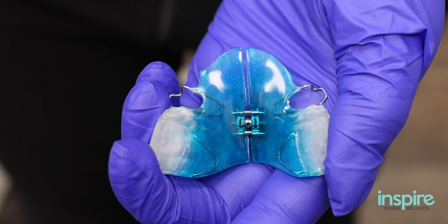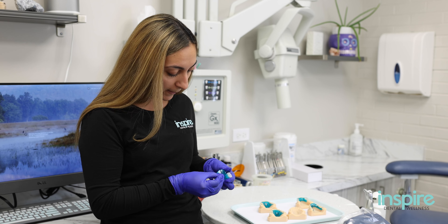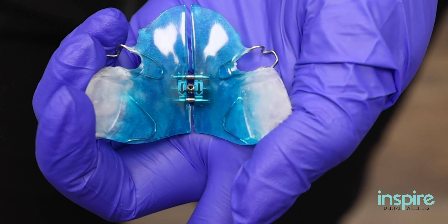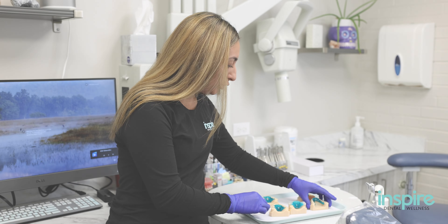When you go to turn again on Wednesday, pick up from where you left off, placing the key in the middle, turn 45 degrees — a new hole emerges. That's where you'll turn on Sunday.